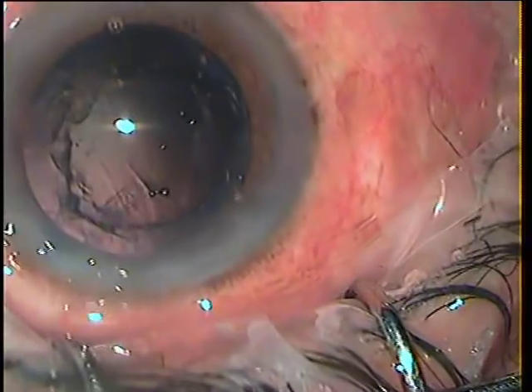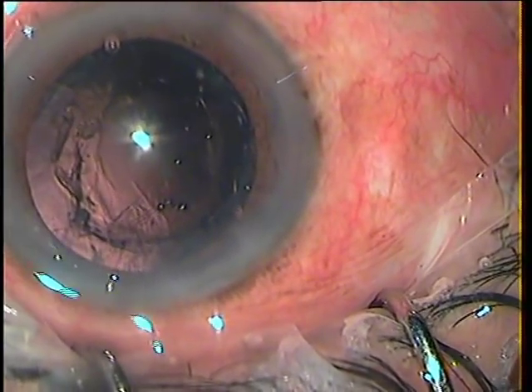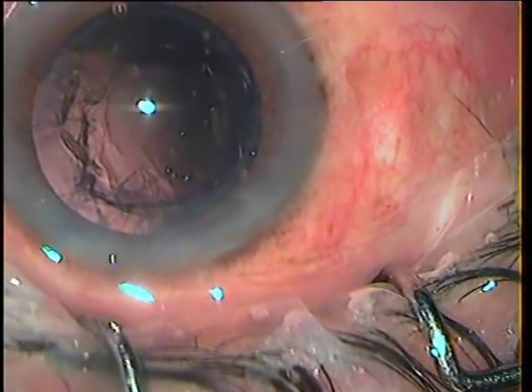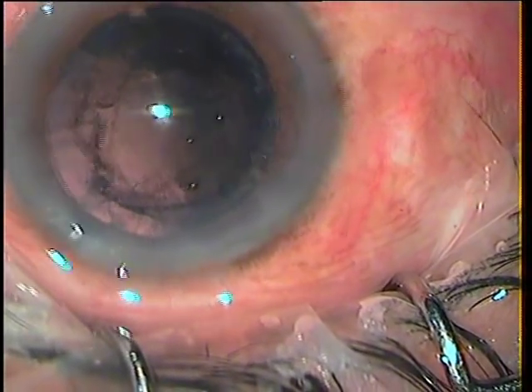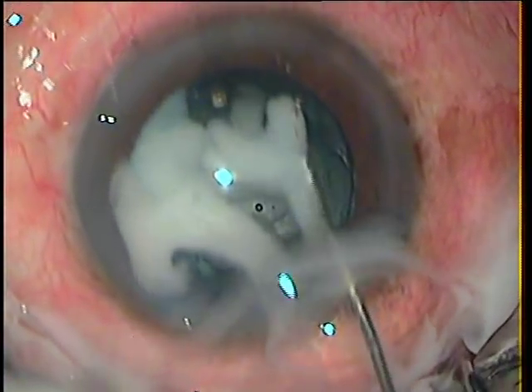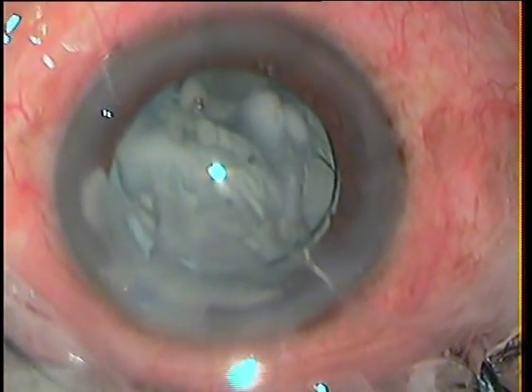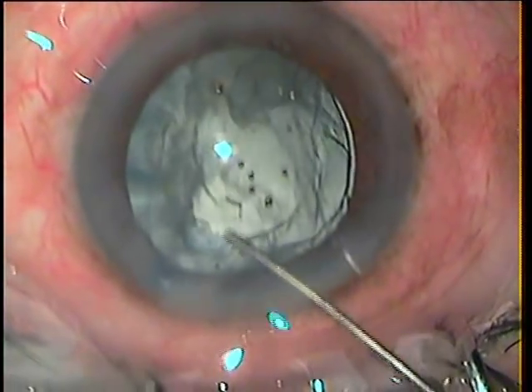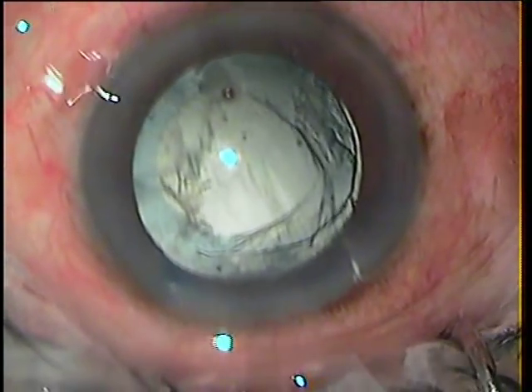I just have to deal with the rent, the vitrectomy, and the cortex removal. I am not very sure how much the vitreous is disturbed, so I proceed with staining the vitreous with triamcinolone. I suspect a strand at the 11 o'clock position coming out of the main port. To confirm it, I inject the dye and then wash it out immediately. That strand coming out from the main port is clearly visible. There is not much disturbance at the rent though.